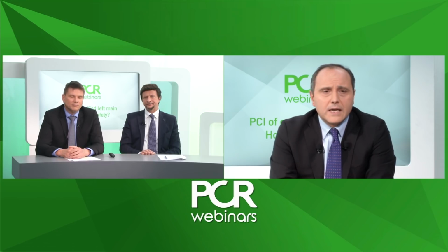Beautiful angiographic result. We still have a couple of minutes. I will quickly go through the remaining questions. We addressed already the issue of the 5mm stent in the circ. I don't think we need to go back on this. About the size of the guiding catheter, we recommended 7 French. I think we all agree on that. Laser versus rotablator. I don't have experience with laser. Quickly, any experience with the laser in this case? No. Neither do I. Then why did you not begin with a 1.5mm burr in the circ? We also addressed this one. I think we addressed most of the remaining questions actually. Let's see what else do we have left.